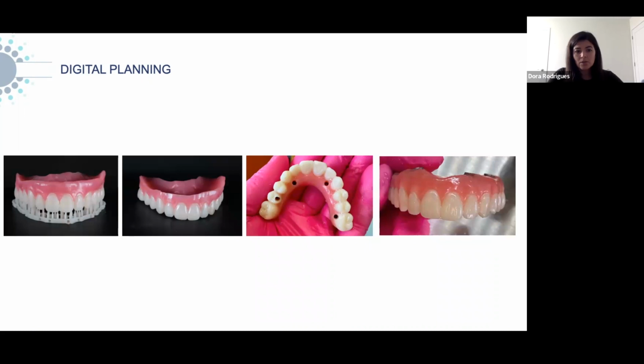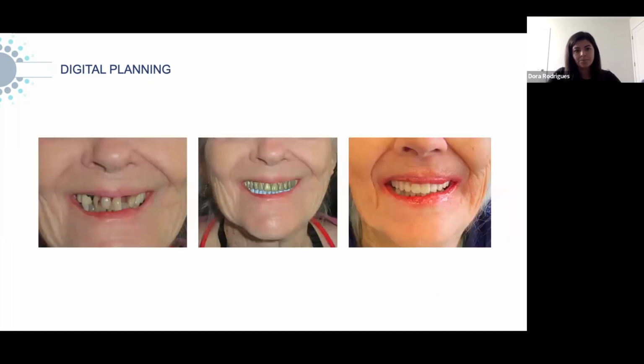And then I bond the two pieces together of Flexera. I use the same resin to bond them together, either the base or tooth resin, the Smile Ultra. I cure, and then we use them for the conversions at the end of surgery. And this is that specific case that I designed and how everything turned out at the end.